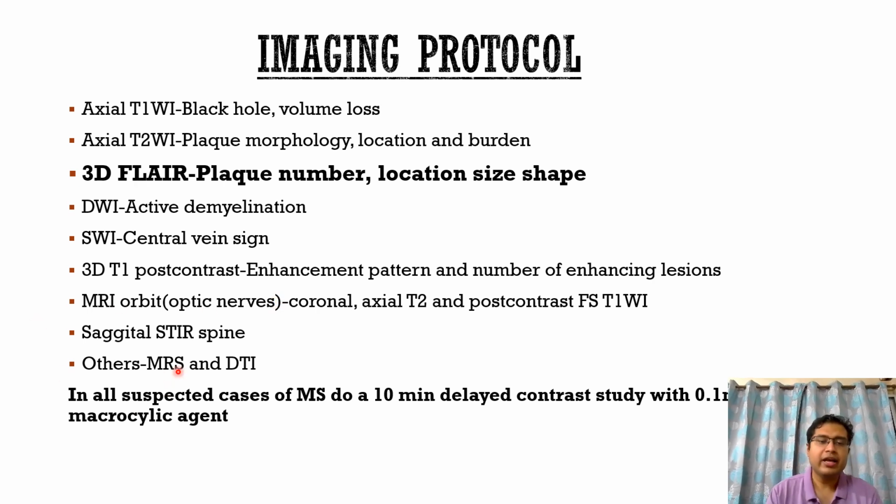Other sequences like magnetic resonance spectroscopy and diffusion tensor imaging can also be used in the imaging protocol if we are suspecting neoplasm as a differential for this particular condition.